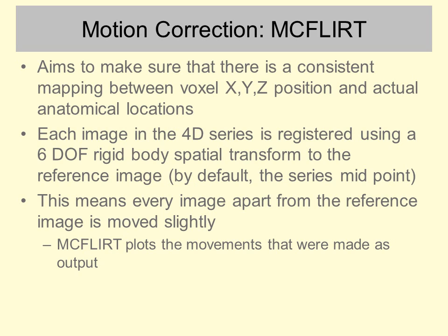So in effect, the set of voxels you're acquiring is moved to track actual motions of the head in the scanner in real time. Of course, it's a bit crude because you're only acquiring an image every 2 or 3 seconds. Therefore, you can only move your volume every 2 or 3 seconds. And so if the person's kind of moving with a high temporal frequency, it's going to be a bit problematic.